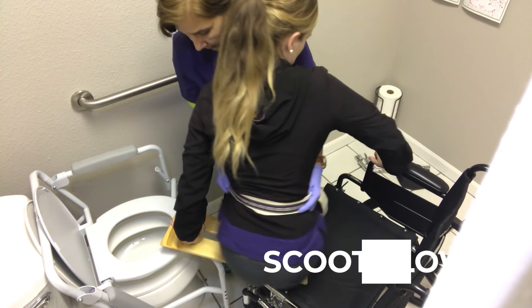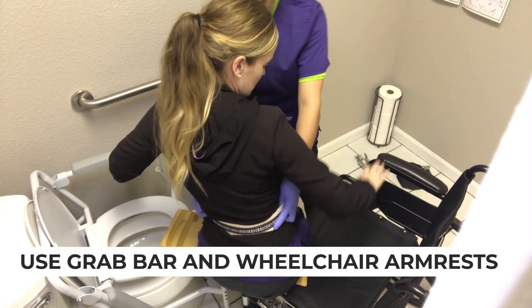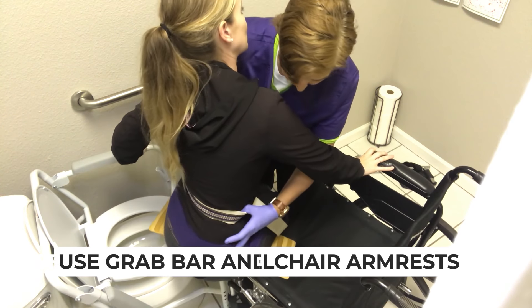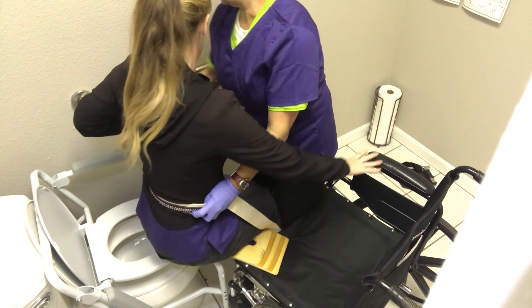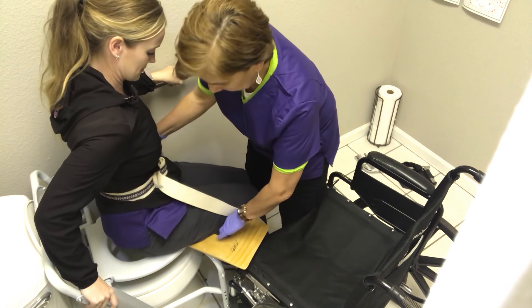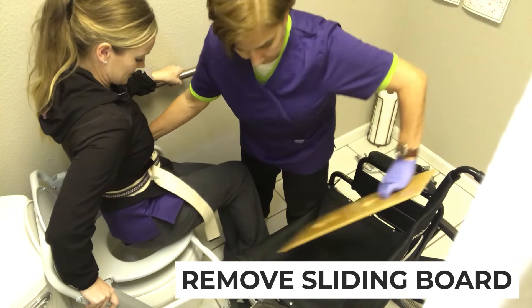We're just going to scoot. They can either hold here and I'm still blocking their knee. I'm transferring them across, then I'm going to put this here and just scoot them back. If they lean that way, I'm just going to move this out of the way.